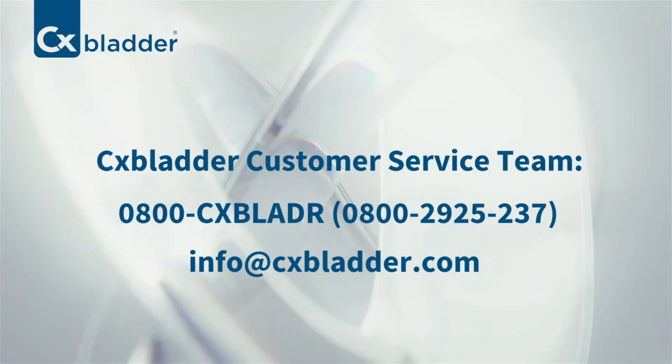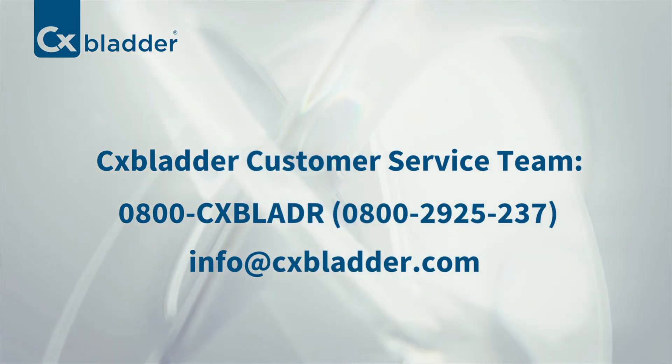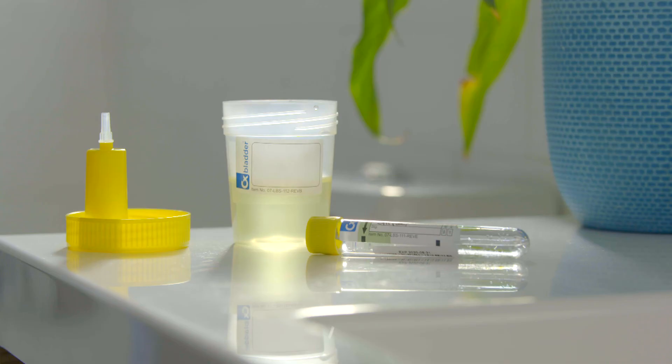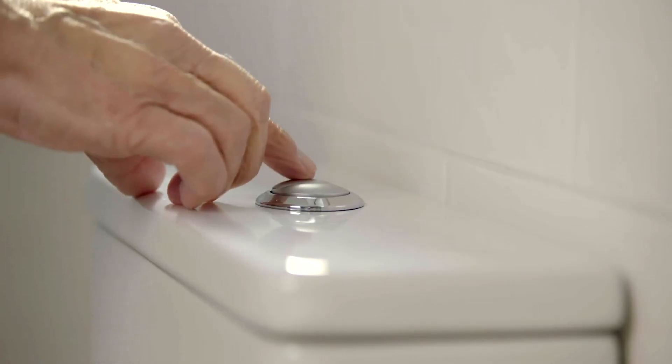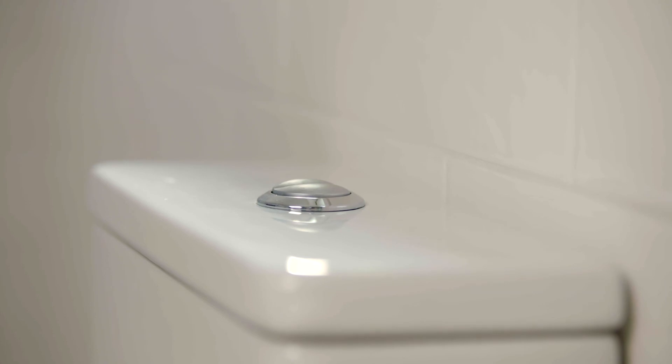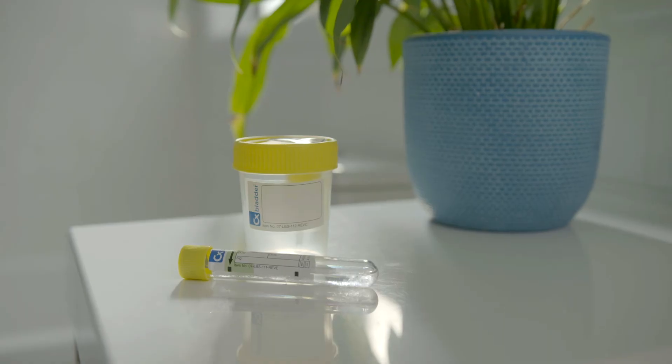If the liquid level is outside the green shaded area, please call our customer service team for assistance. Once you've transferred your sample to the test tube, remove the lid from the CX Bladder urine collection cup and dispose of any remaining urine into the toilet. Then replace the lid onto the CX Bladder collection cup and secure tightly.